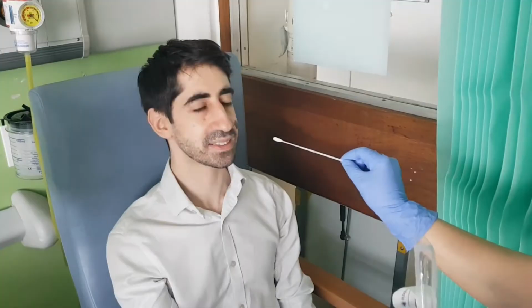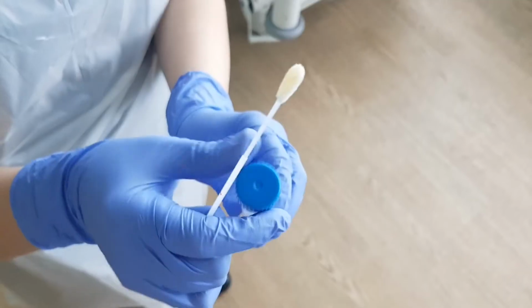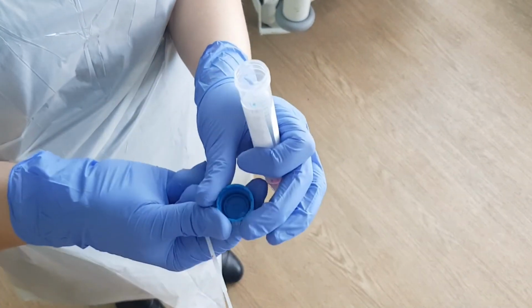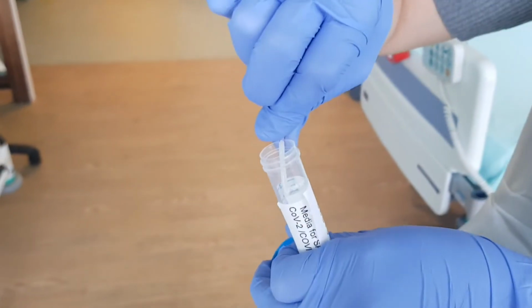Ask the patient to lean their head back and open their mouth wide. Swab each side of the back of the throat. And then swab each nostril using the same swab, applying just a bit of pressure. Once that's done, open the sample container and put the swab in it, snap the swab, and close the container.